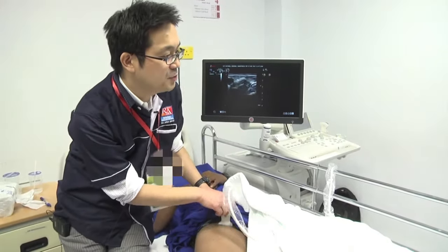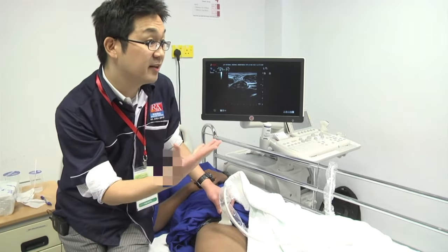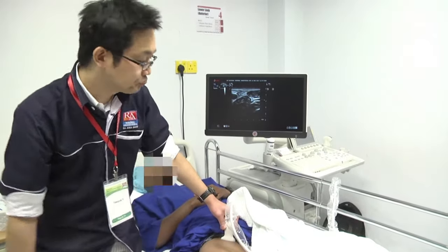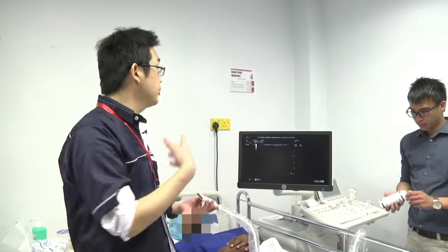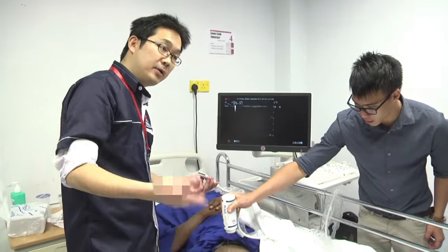So I usually teach the distal approach first for beginners. After that, I teach the proximal approach. So do you have any question about the obturator canal block? Okay, so I'm going to talk about adductor canal block. After that, you can try.